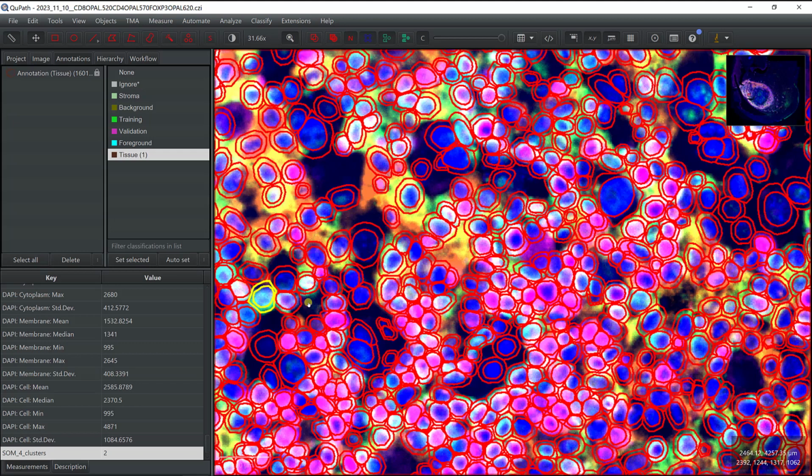And if you have many markers, like now with hyperplexed images, you can easily go up to 40 markers, then that might be a good strategy, because you will still spend way less time thanks to the unsupervised clustering, but you just make sure that you make the right decision when the markers are not that optimal.